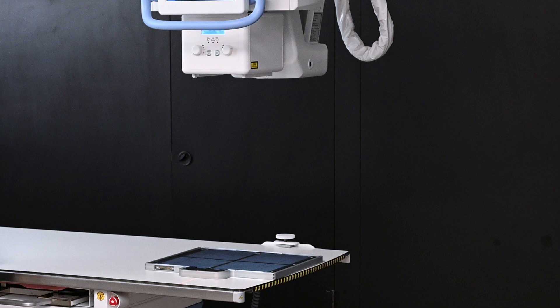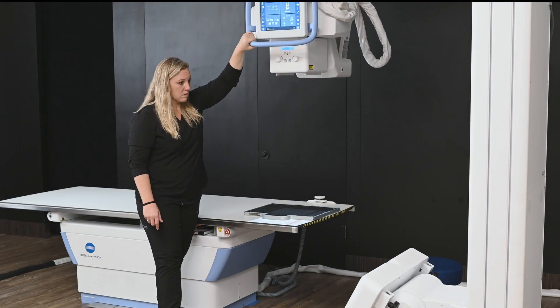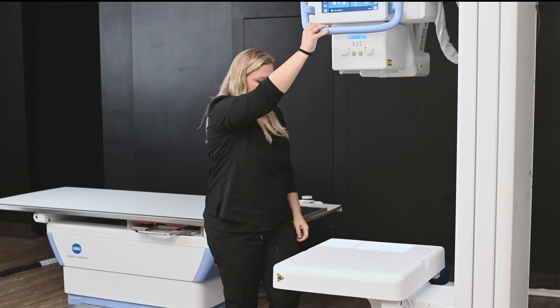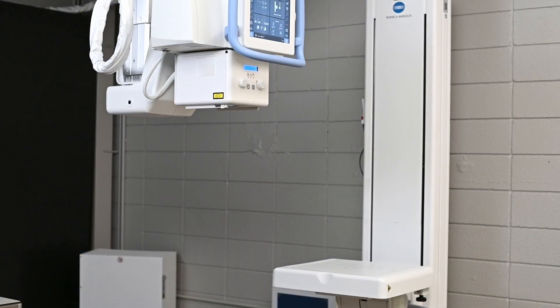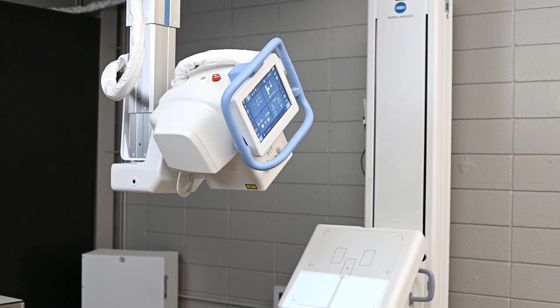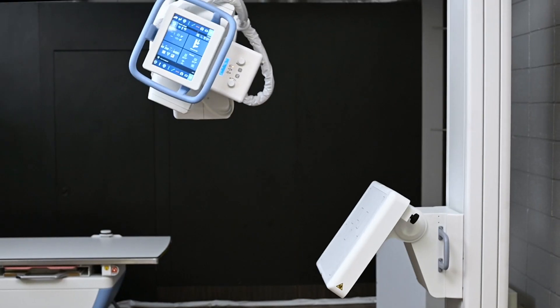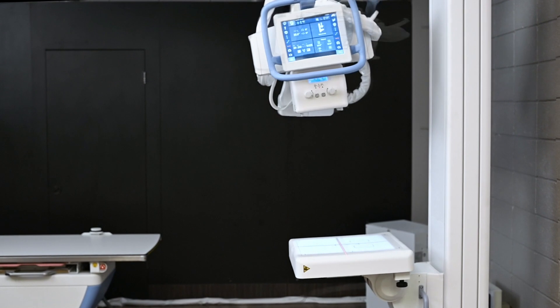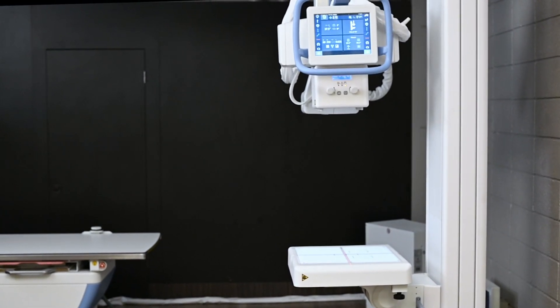Some of the great features of the Flex overhead tube crane: you can traditionally use it for upper extremities at the end of the table, but you also have the capability of doing unlimited auto-presets for your extremity work as well as the upright. It will automatically track, the upright will automatically tilt, and create a 40-inch SID to do your extremity work — whether it's an axial shoulder, hand, wrist, elbow, or forearm. Great functionality using both the upright and the table.